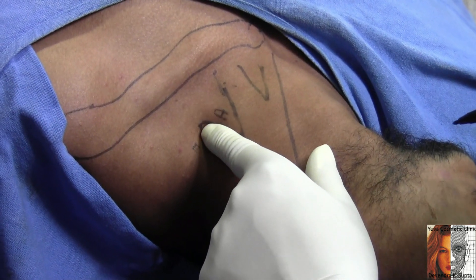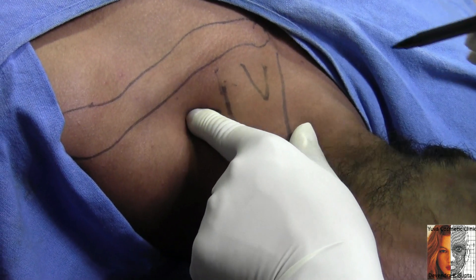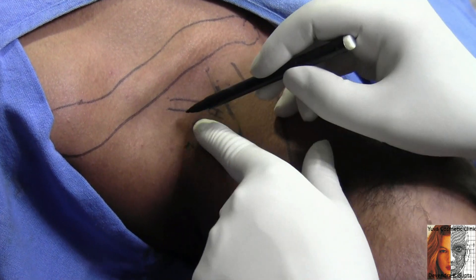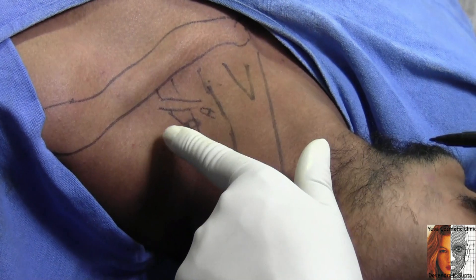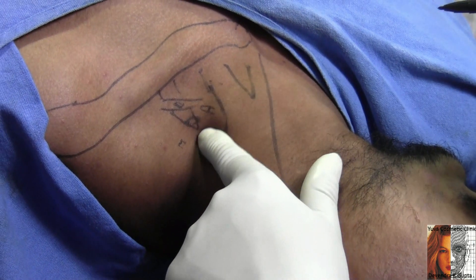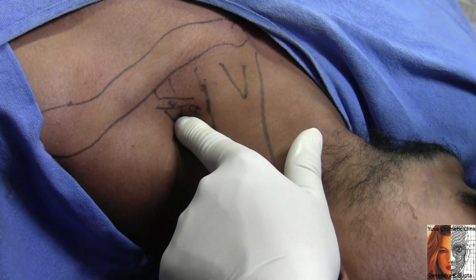Now I am moving my finger a little down. I can palpate the inferior belly of the omohyoid. This interscalene cleft is divided into two: the cleft above the omohyoid and the cleft below the omohyoid. This circle I have marked in the interscalene groove is through which I will insert the needle to block the brachial plexus.